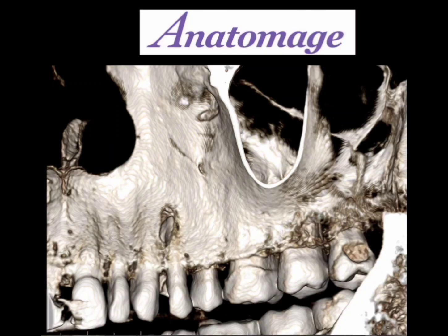I am Dr. Prasad. Today I shall be sharing an interesting and challenging implant case involving immediate implant placement in relation to tooth number 24. This case was unique because the patient had a grossly decayed tooth, a periapical abscess, and a buccal cortical defenestration defect. Despite these challenges, we were able to successfully place an implant immediately after extraction. Let's go through the entire case step by step.